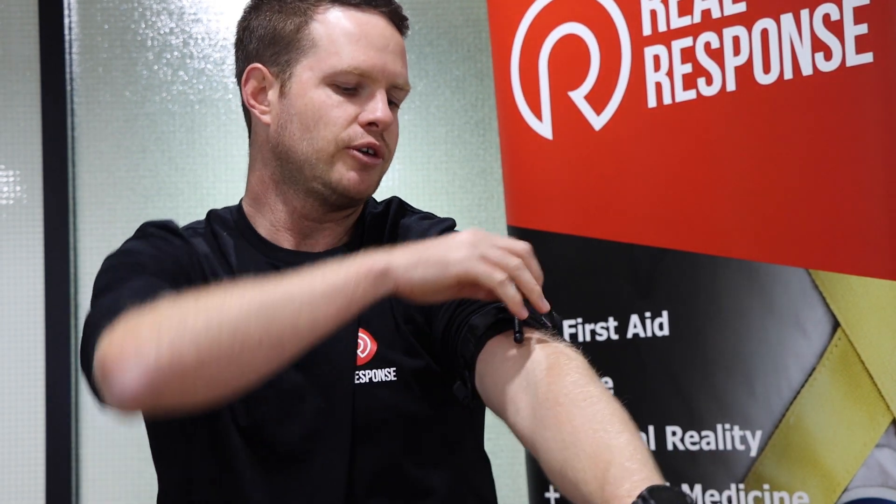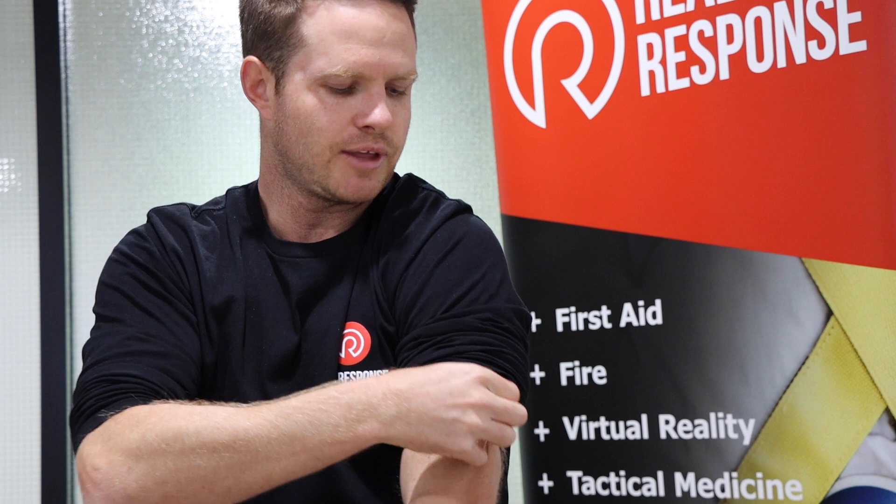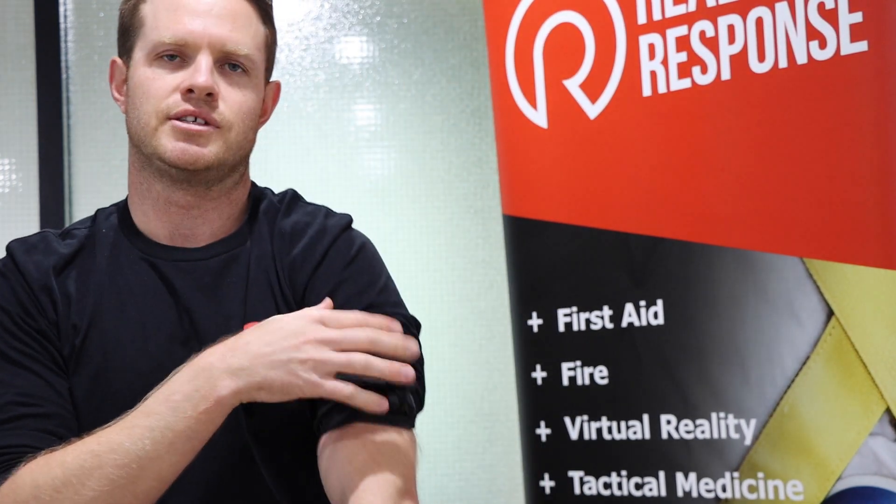Once it's nice and secure, start twisting the windlass exactly like the CAT tourniquet. Once you're happy that the bleeding has stopped and they don't have a distal pulse, feed it into those C-clips, and with the triangle you can feed it through as an additional secure measure.